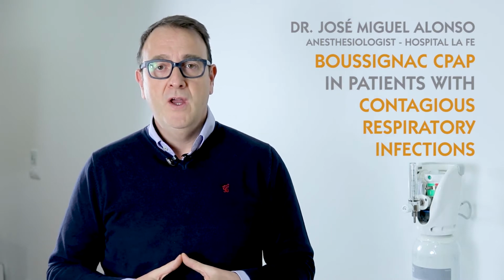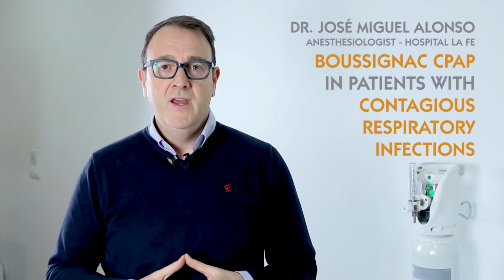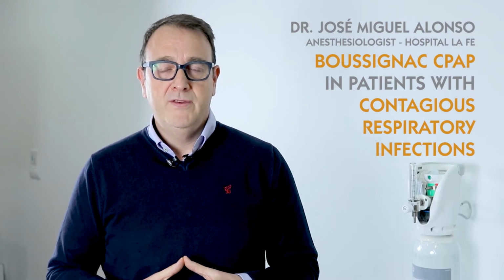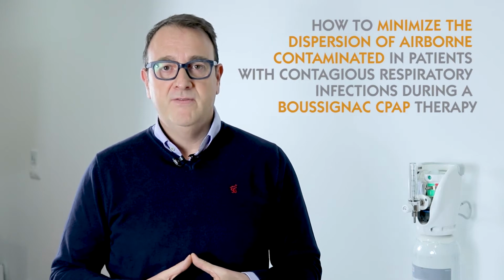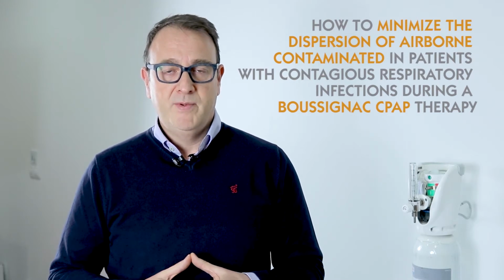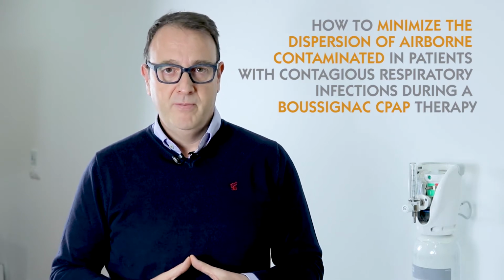I'm going to show you how to use the Boussignac CPAP in patients with hypoxemia or with pneumonia related to virus infection. I'm going to try to show you how to decrease the possibility of airborne spread during the CPAP therapy and also during the high flow therapy.